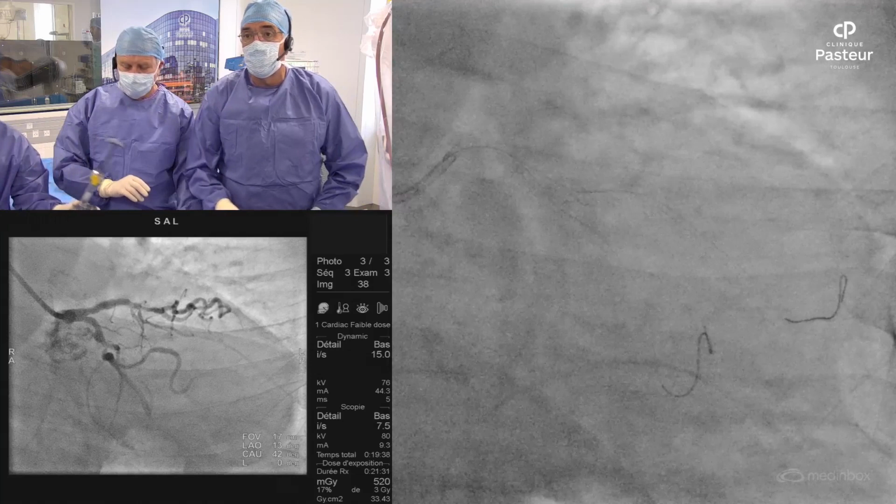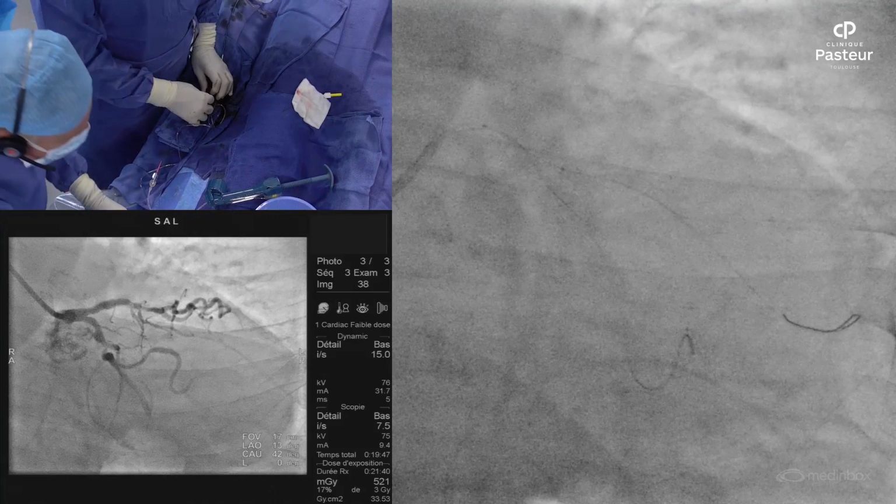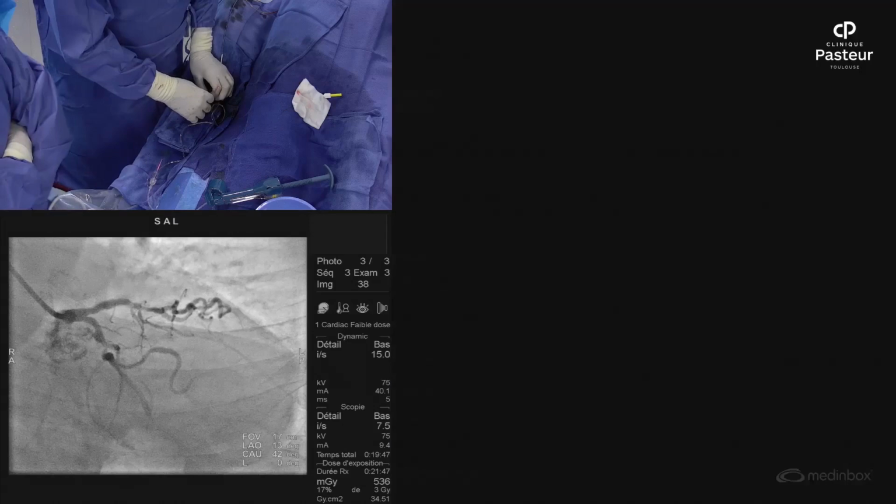Where we are, it's difficult to cross. This is 20. So take a picture, and then we will see if we need 24 or shorter. Is 20 enough, isn't it? Yeah, or 18, it's 18 or 21. So 18, 21, I would say.